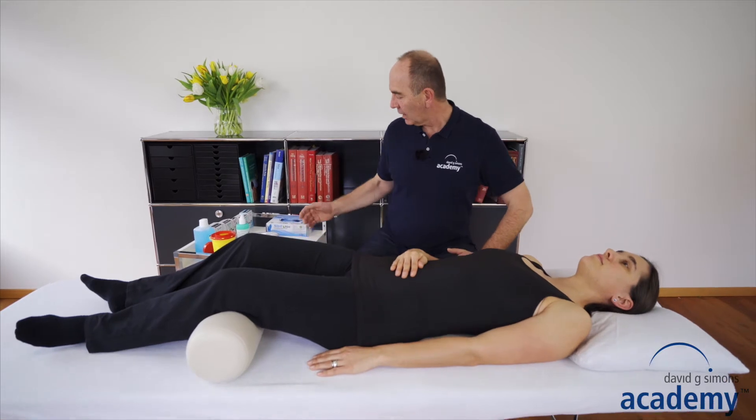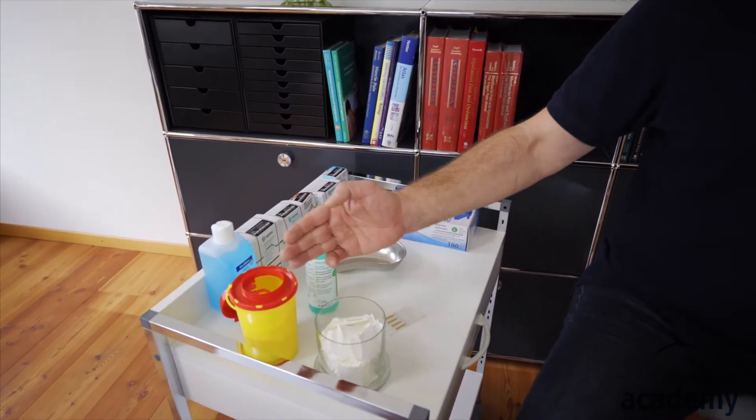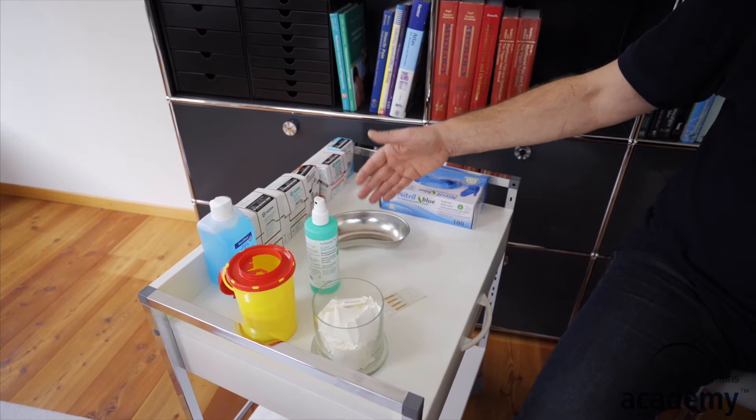The equipment I recommend to have it on a trolley. On the trolley you have swabs, needle collector, hand disinfectant, disinfectant spray, of course needles, a tray for the trash, and gloves.